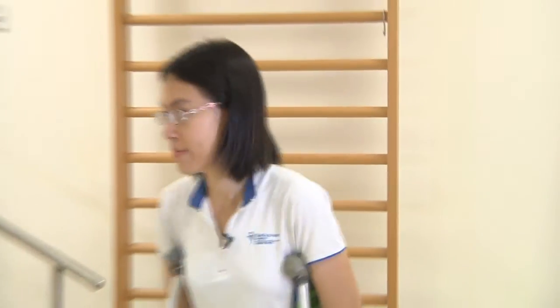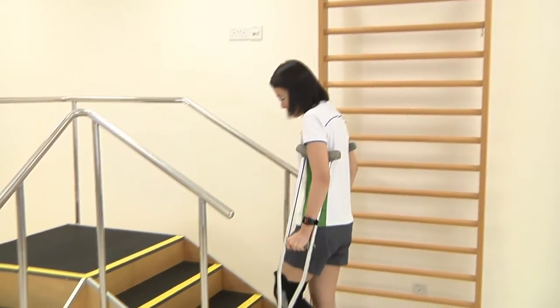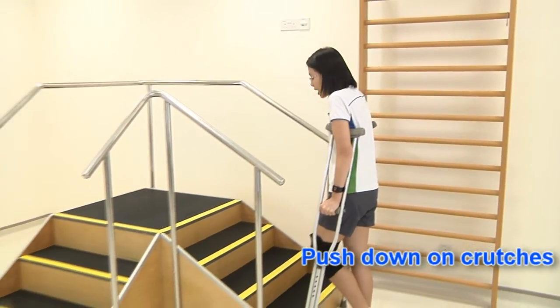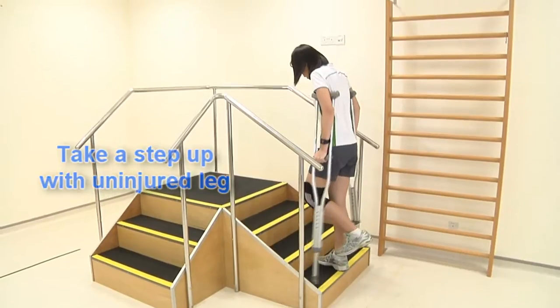I'm going to teach you how to move up and down the stairs with a pair of crutches in a non-weight bearing situation. First, move to the base of the stairs. Push down on the crutch and take a step up with the uninjured leg, followed by the crutch.